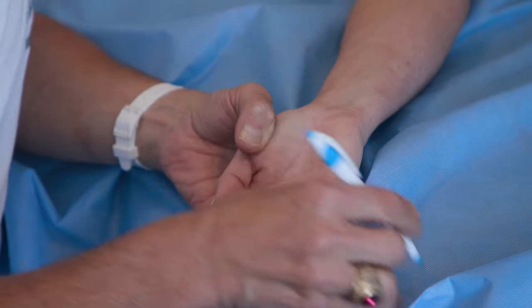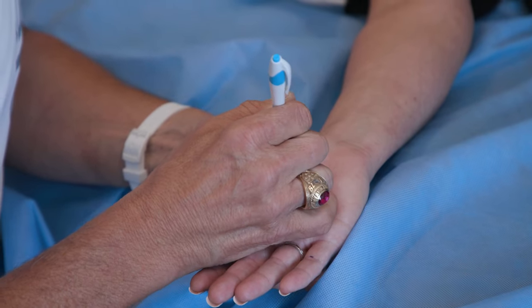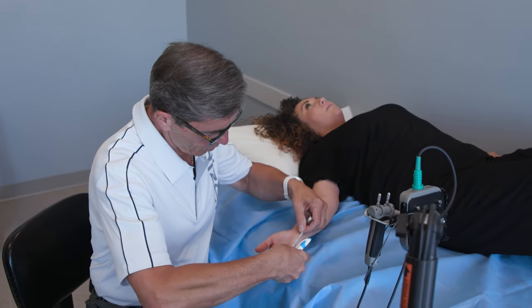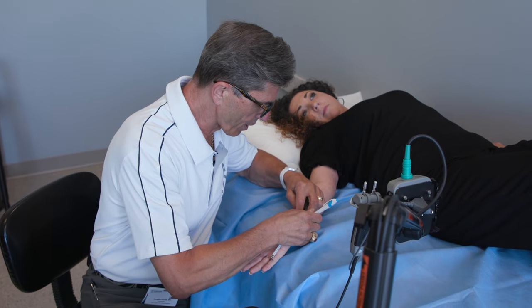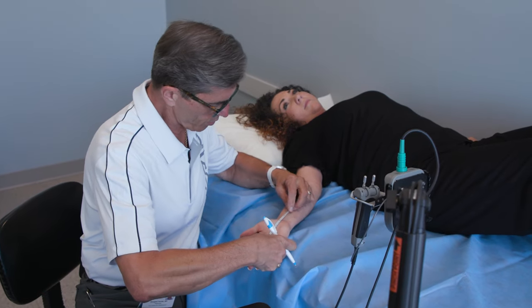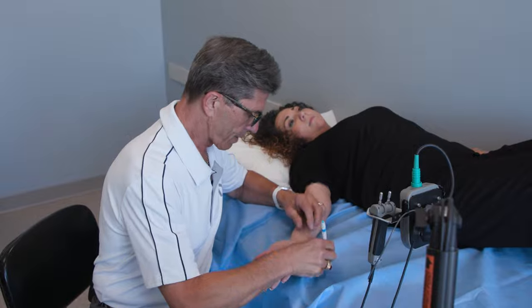We'll remove these marks at the end. After we finish this, we're going to take some small sticky pads that look like EKG electrodes and put them in different parts of your fingers to record the results of the shock. If at any point it gets really uncomfortable, you just have to let me know because we can always do something to modify what we're doing.